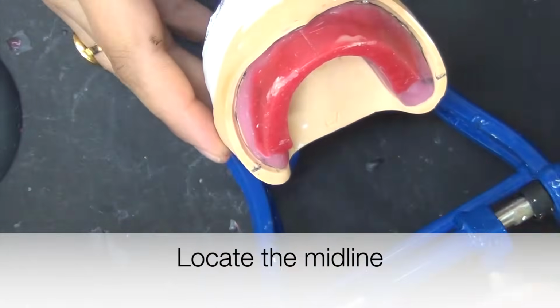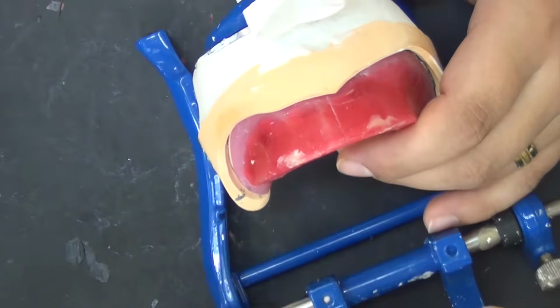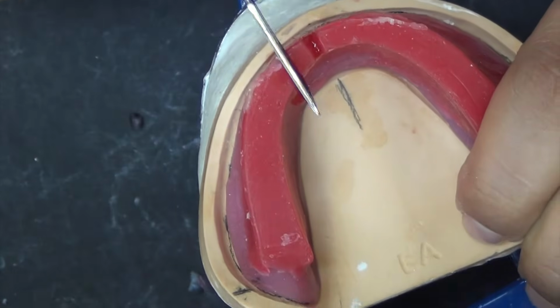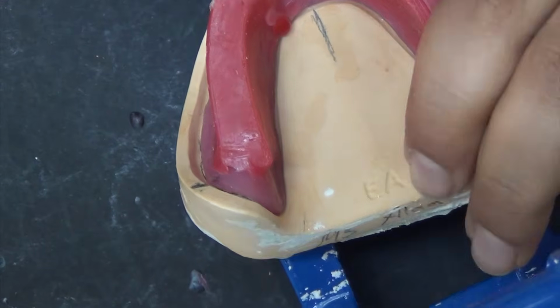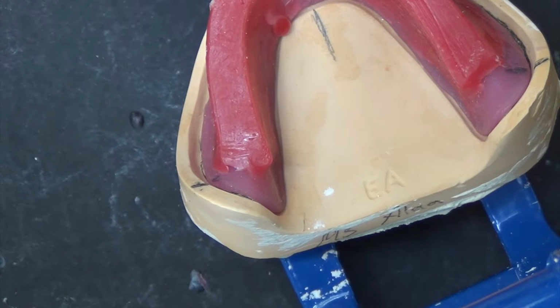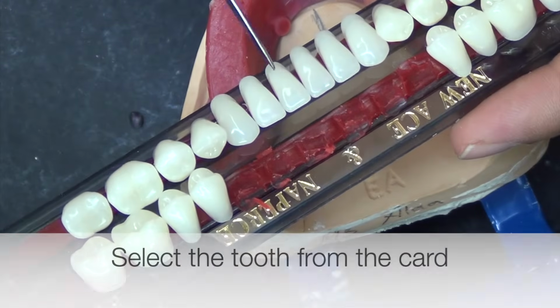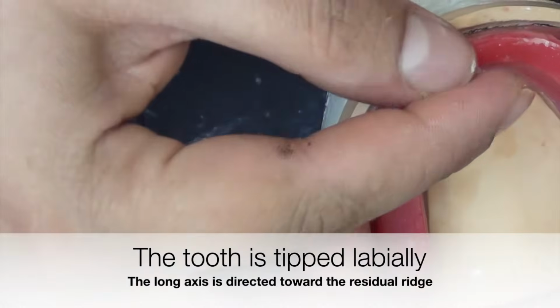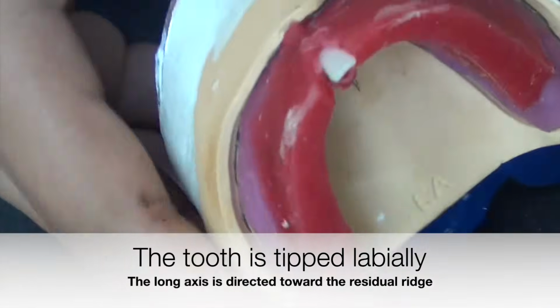The central incisors are set at the midline and tipped slightly to the labial. Direct the long axis of the tooth toward the residual ridge. The tooth is slightly tipped labially, and the long axis is directed toward the residual ridge.